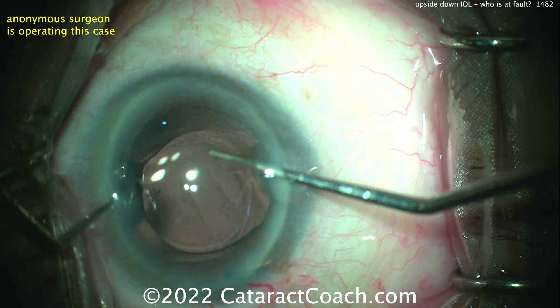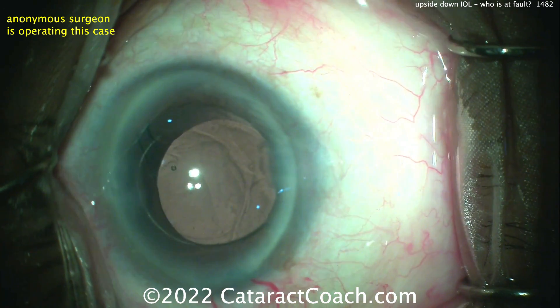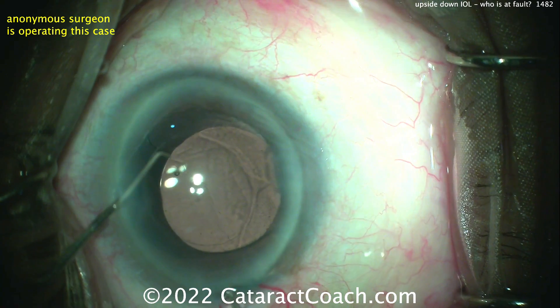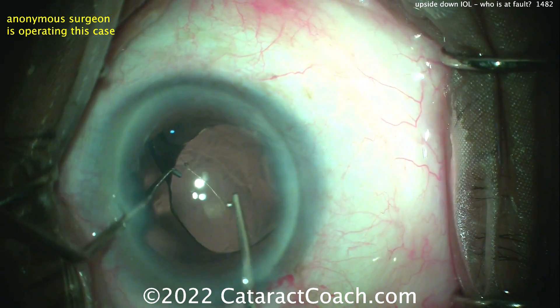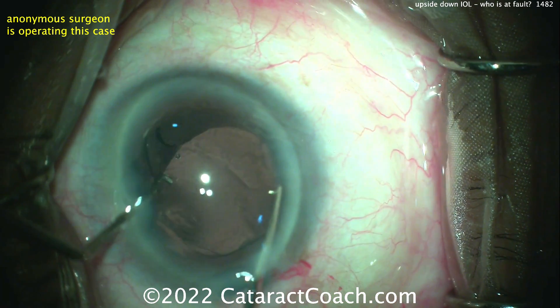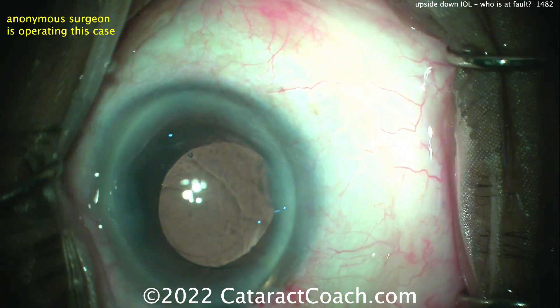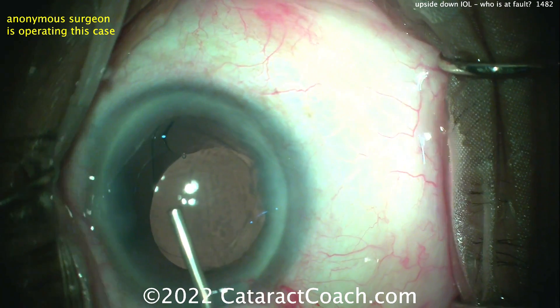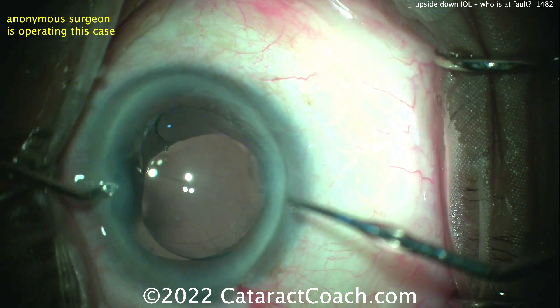This surgeon is going to flip it. Use plenty of viscoelastic in the eye; it would also help to get the lens partially out of the capsular bag. The key is to be very careful: you don't want the haptics to damage or destroy the capsule. If the bag breaks, you may need to explant the single-piece lens and switch to a three-piece or sulcus lens, so you have to be very careful here.